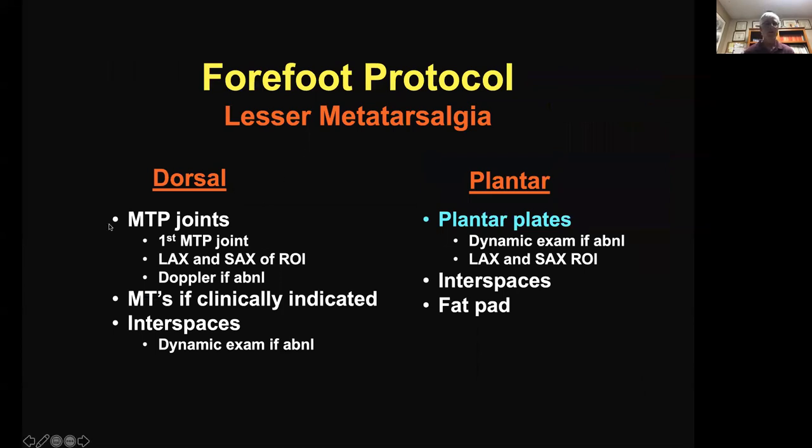All right, so that's my exam dorsally. I will wipe off the gel. I'll dorsiflex the ankle so I can get to the plantar aspect of the foot. And I start with the plantar plates. I survey the plantar plates in long axis. And again, I perform dynamic exams in short axis if abnormal, or again, the region of interest.